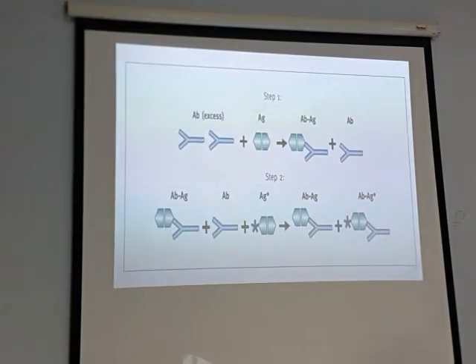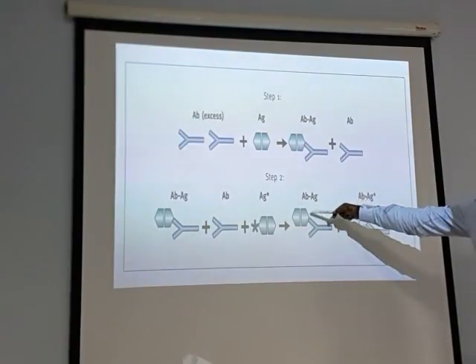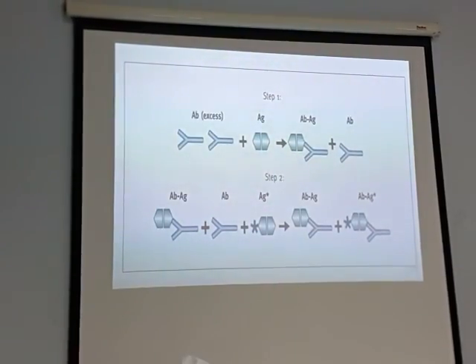Now it is positive because we have a number of antibodies, and we already got the antigen antibody complex. So how will we estimate which is negative or positive? If this labeled antigen antibody complex is less, it means more unlabeled antigens are attached to the antibodies.